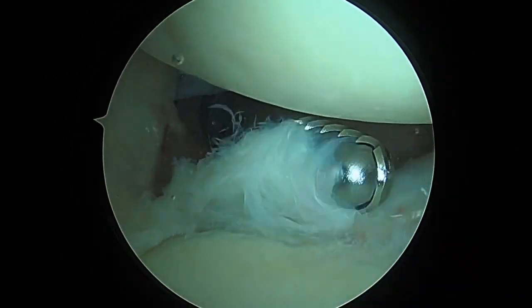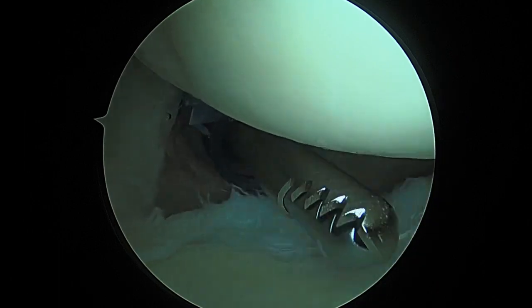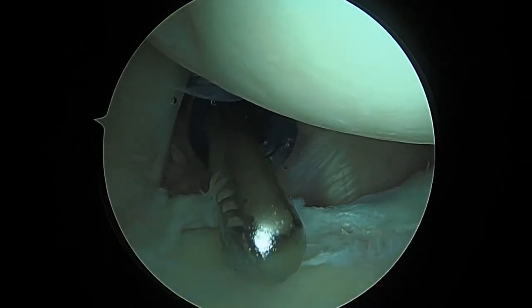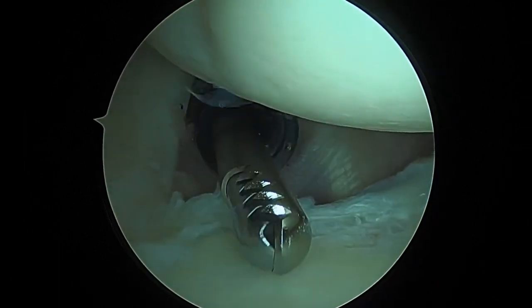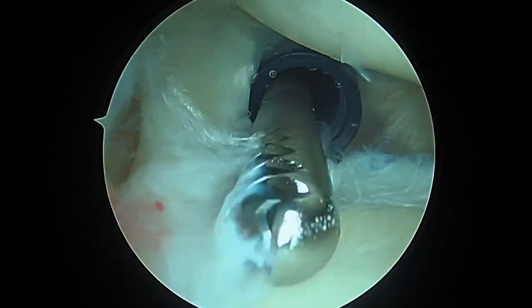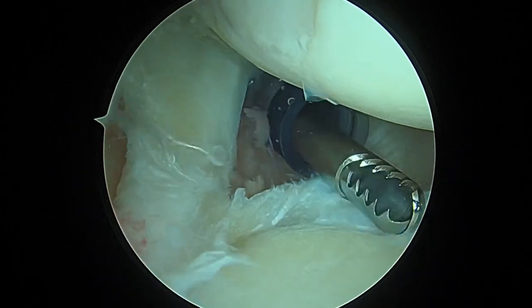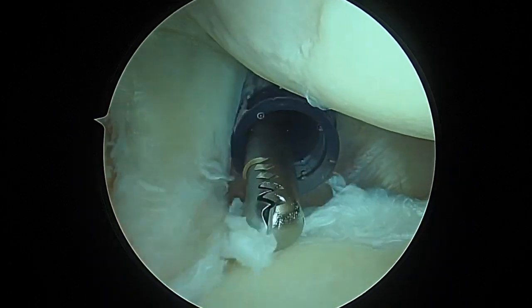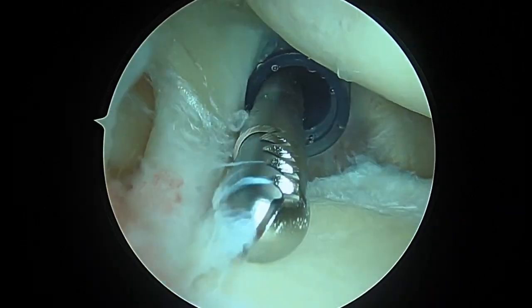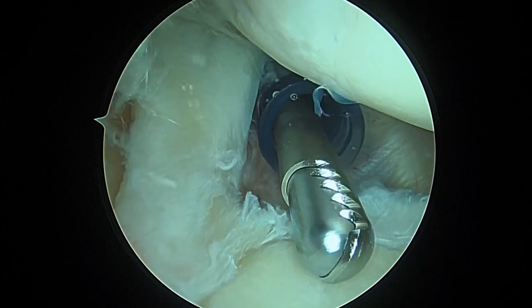This tool has a little suction attached to it and it allows us to smooth out some of the torn tissue so we can see exactly what's going on. Right now we're working on the labrum. To the left of that is your biceps tendon, and you can see all these rough edges and things kind of hanging down — that's not normal. These are all areas where the labrum or the biceps tendon are torn, which is what we expected. A little bit more to the left of that is going to be the rotator cuff tear.